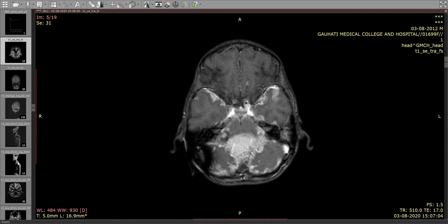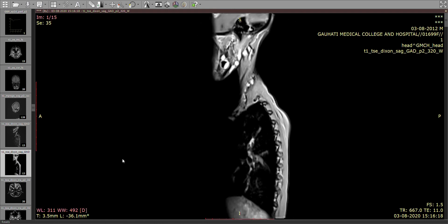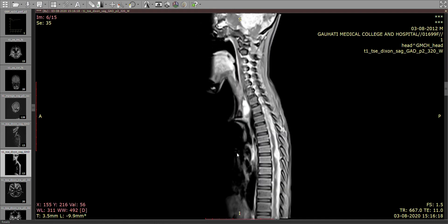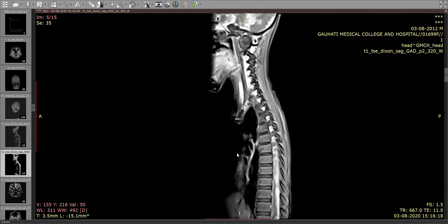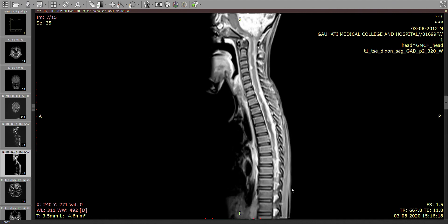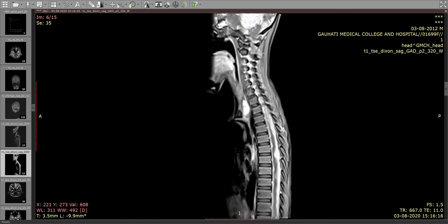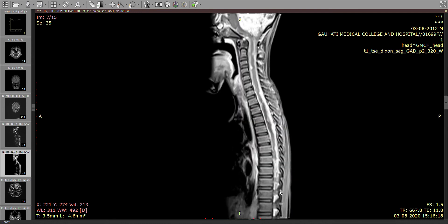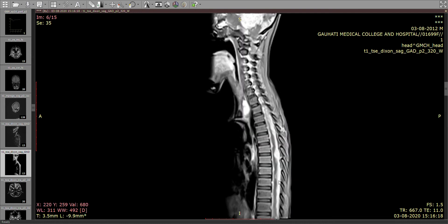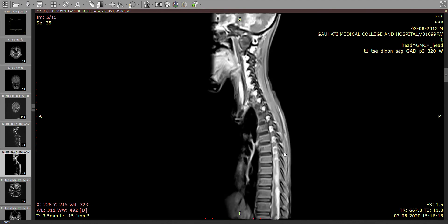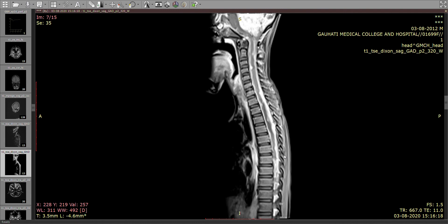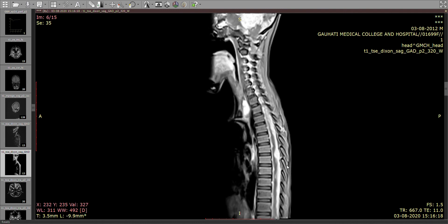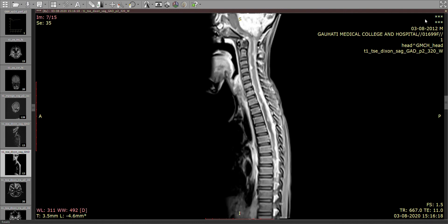The next step would be a screening of the spine. Here we see extensive drop metastasis in the spinal canal, extending down to the lumbar region. So this is a case of medulloblastoma with CSF drop metastasis.